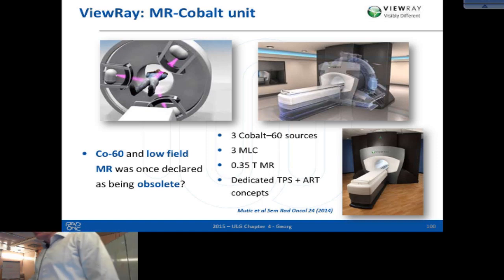One question there is noted that cobalt 60 is used for total body irradiation. Yeah. So does that mean, for example, fighting leukemia? Right, yeah. So total body irradiation, I mean, you can do that in many ways, and there are many different treatment concepts for total body irradiation.